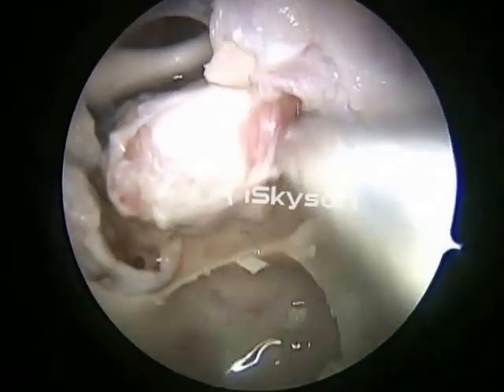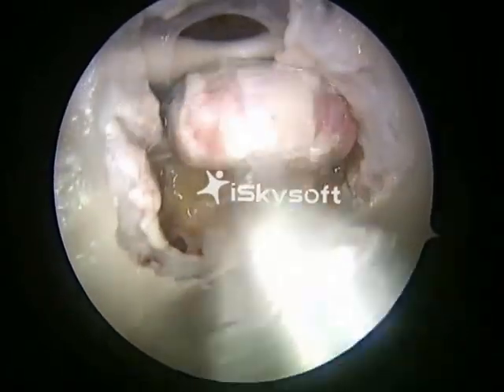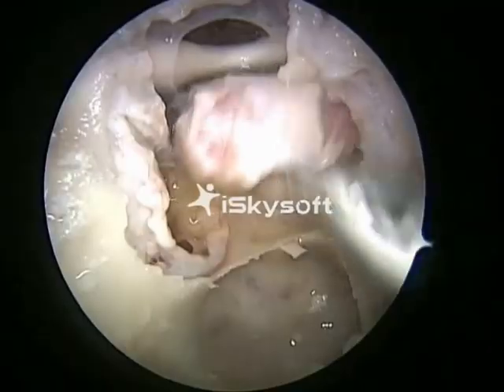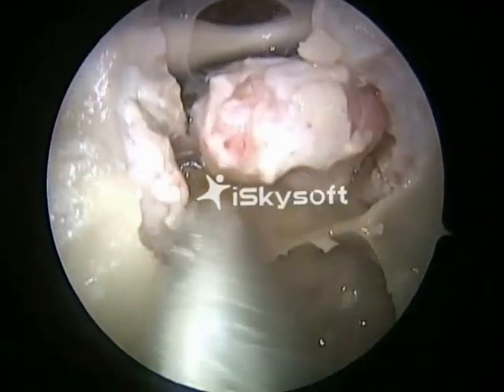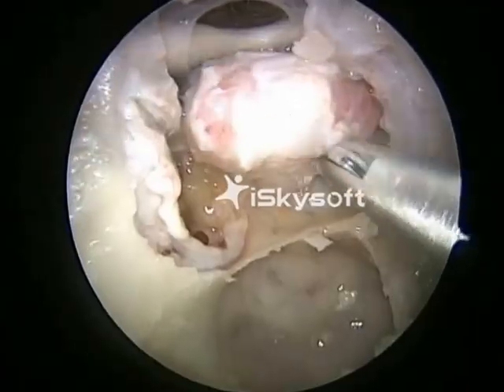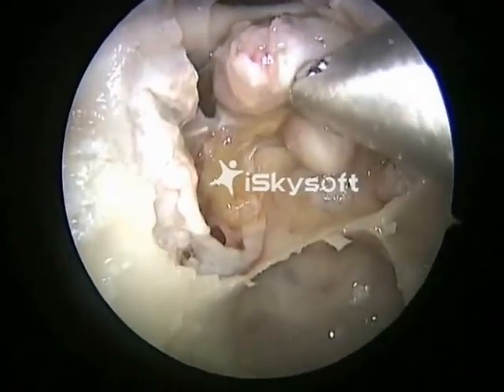And it is being rotated upwards. That's the dorsum sellae, from which the pituitary gland is being separated.